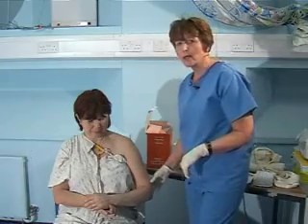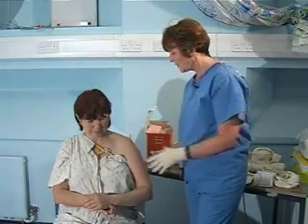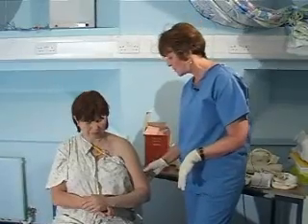First of all, we're going to demonstrate a U-slab. The patient comes in with a terrible lot of pain and a lot of swelling.